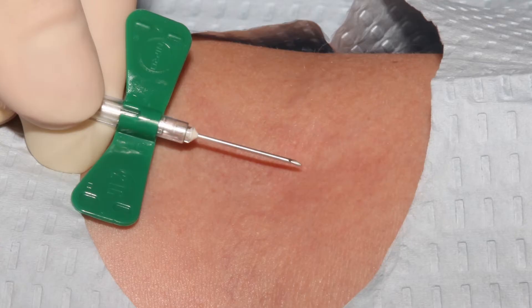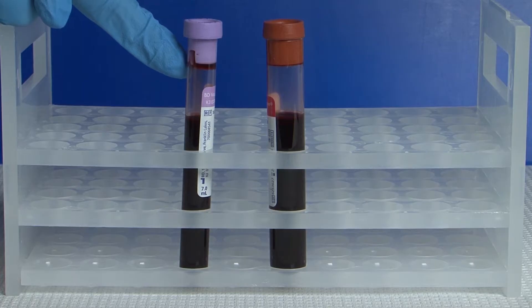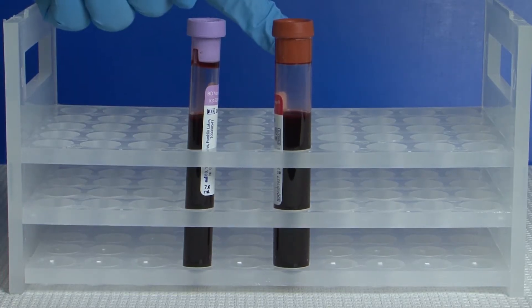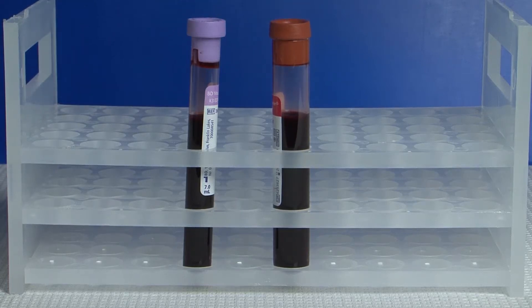These blood samples are typically those obtained upon admission to labor and delivery, such as a lavender top tube, generally used to obtain complete white blood cell counts, hemoglobin, and hematocrit, as well as a red top tube, which is generally collected for blood type and cross-matching.